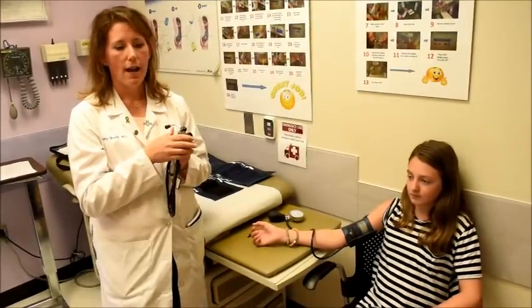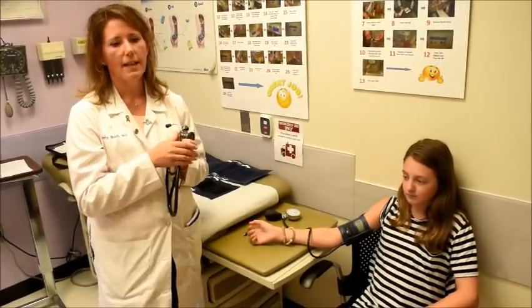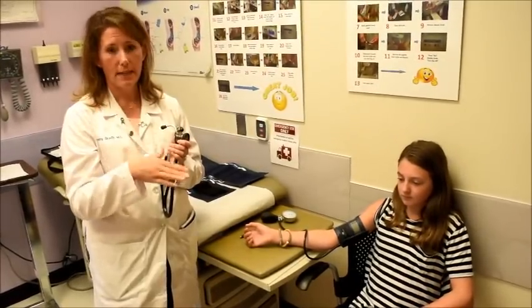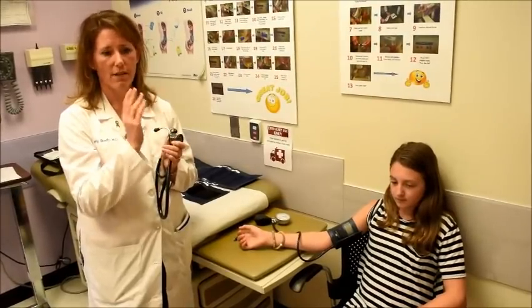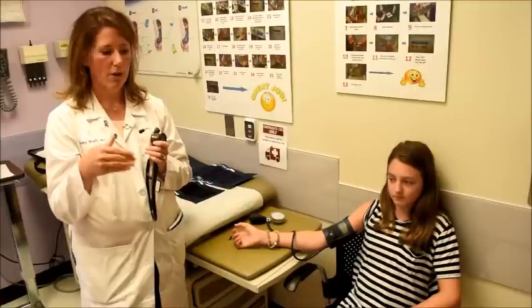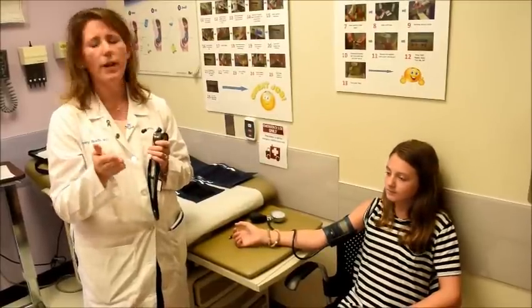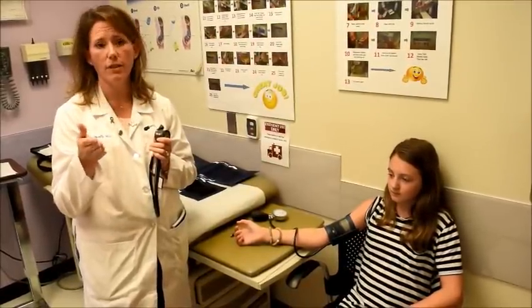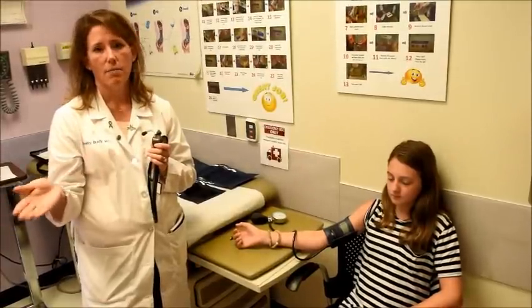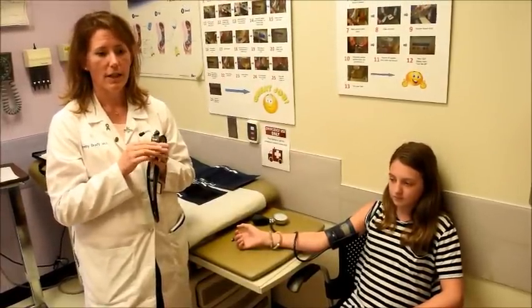So K1 is your systolic blood pressure, and that's the point at which you hear several rhythmic beats. So not just one beat, but you want to have at least two rhythmic beats. And the first one of those rhythmic beats is going to be K1. And then the point at which the Korotkoff sounds become muffled is K4. And the point at which the sounds disappear is K5. So those are the three measurements that you're going to be recording.